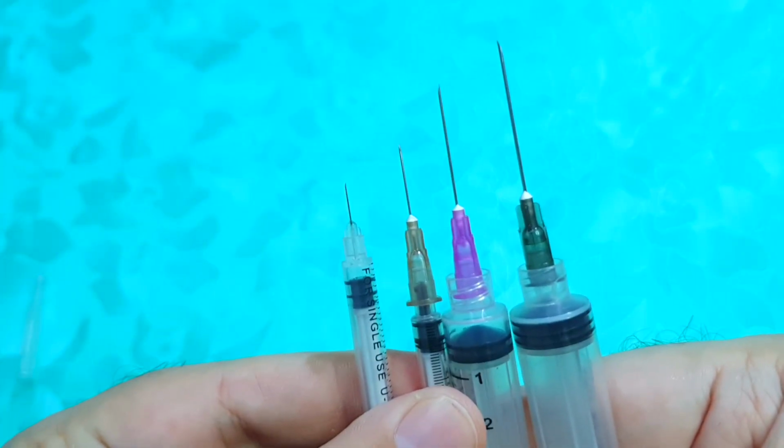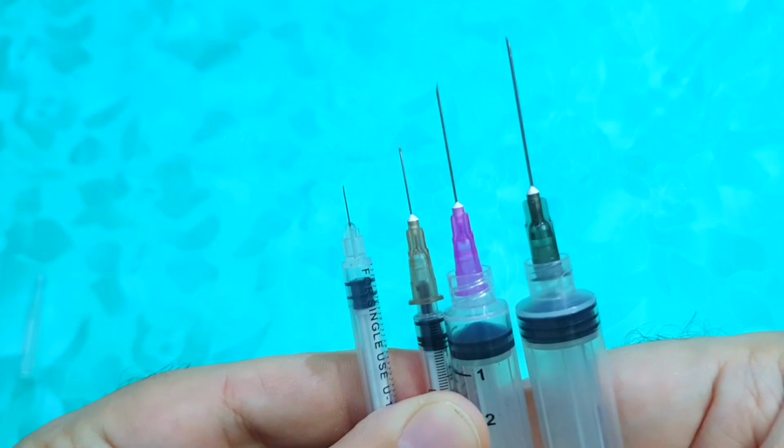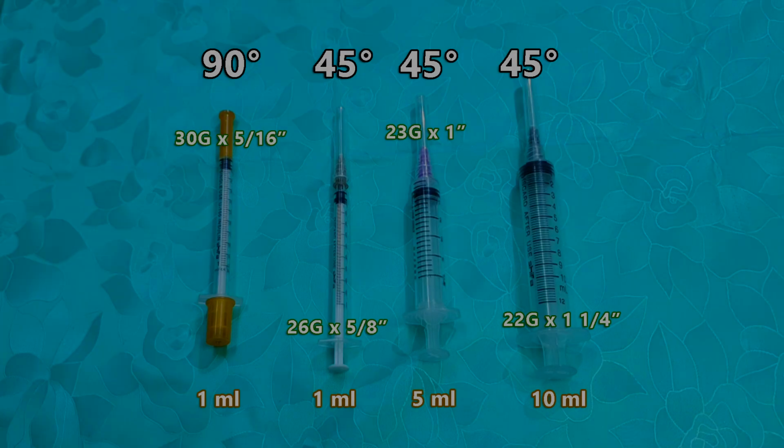Let me put all the needles side by side so that you can see how their thickness and length compare to one another. The gauge size and length of each needle is shown on the screen. The shortest needle here is always given at 90 degrees angle. The remaining longer needles are given at about 45 degrees angle.